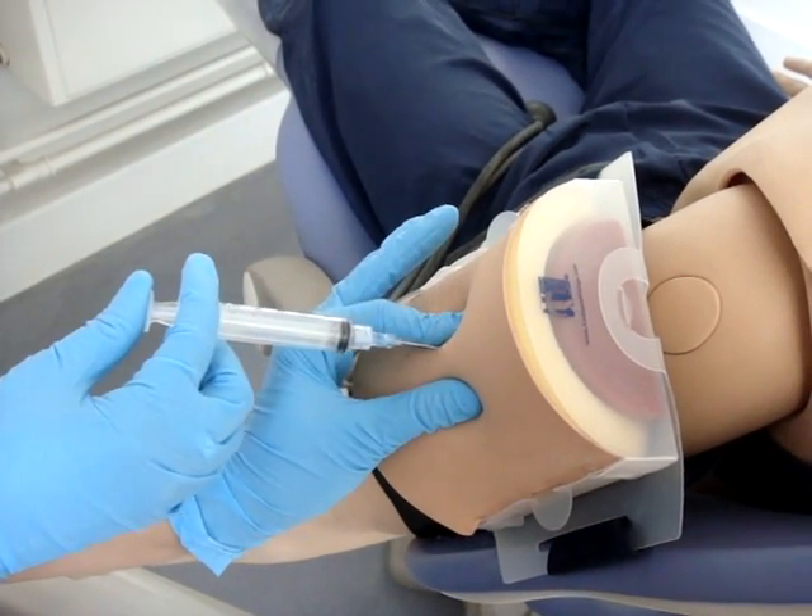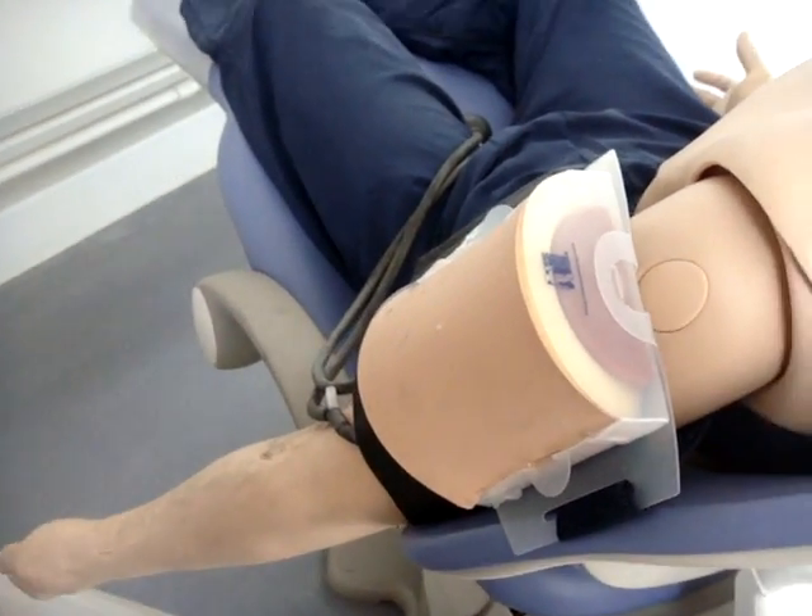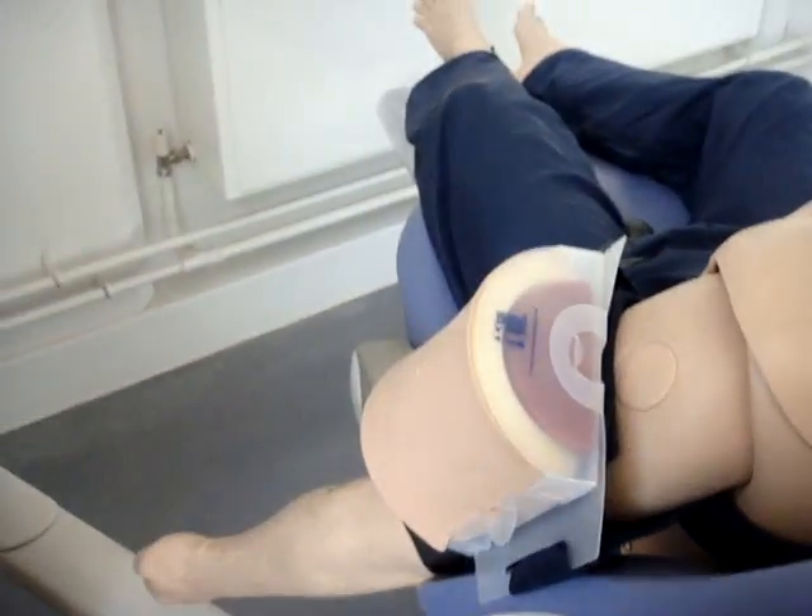Remove the needle. Release the muscle. End.